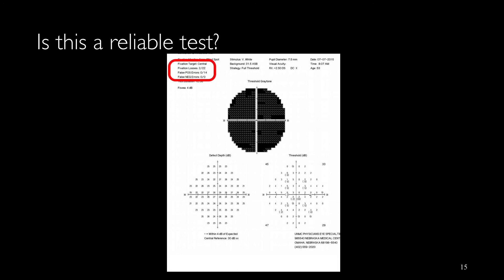Is this test reliable? Based on the reliability indices that we have at the top box it looks reliable, but if you look at the gaze graph it shows a lot of fixation losses that makes this visual field unreliable.